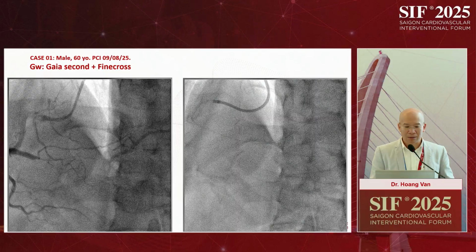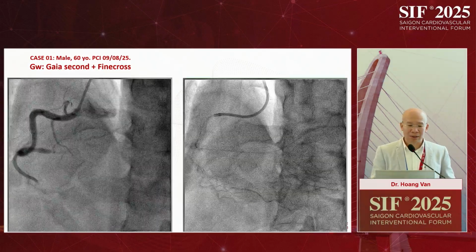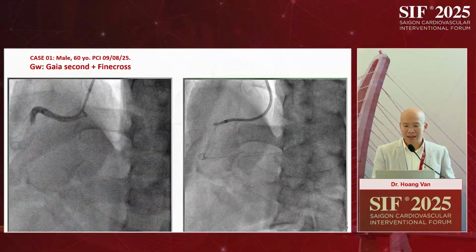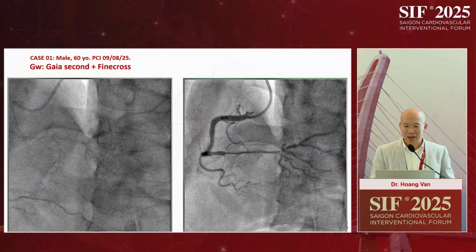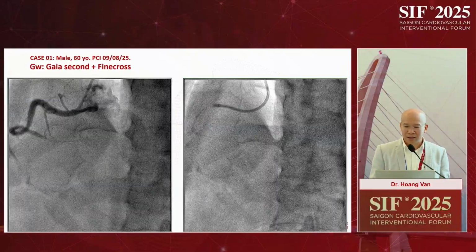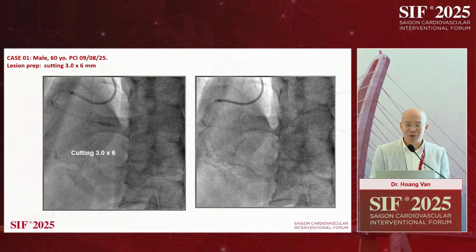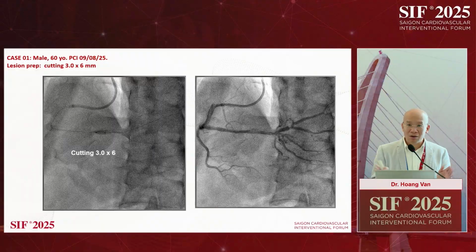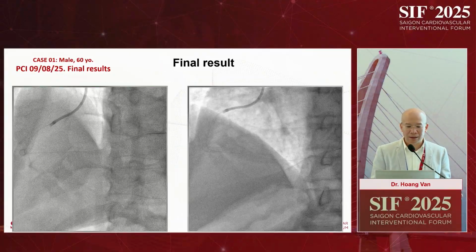After the wire successfully crossed the quite wide lesion, we used a cutting balloon 3.0 to prepare the lesion.